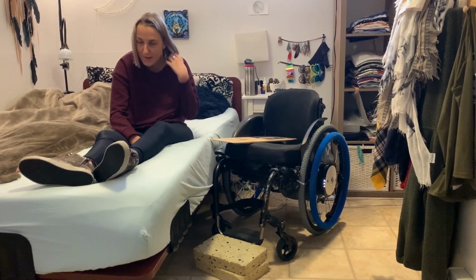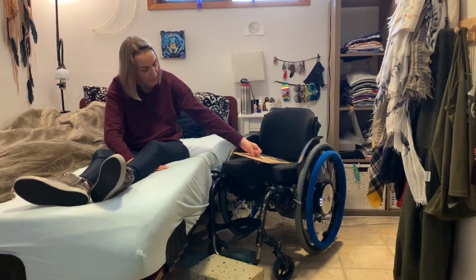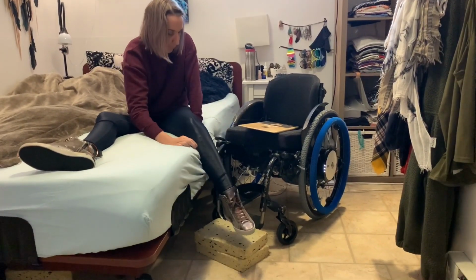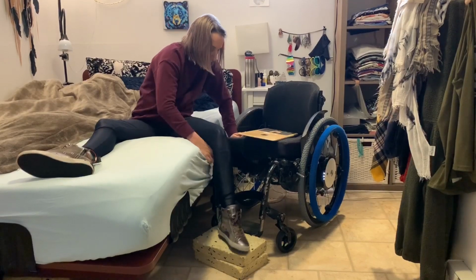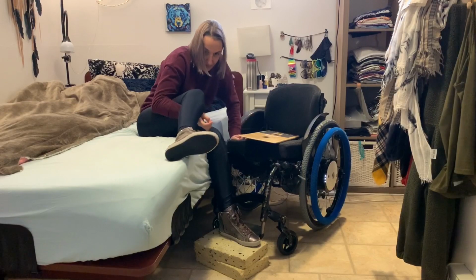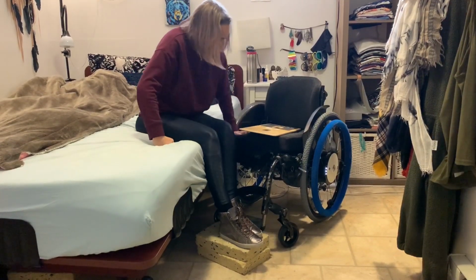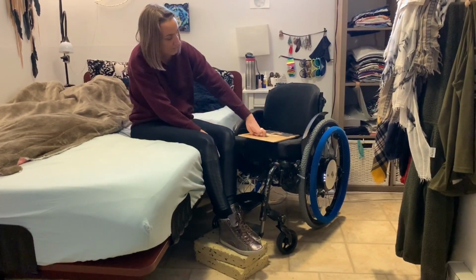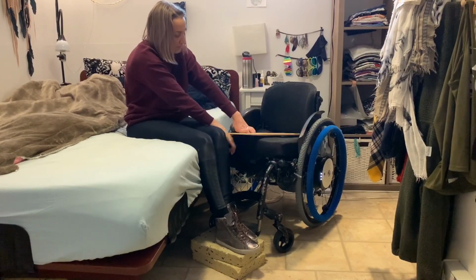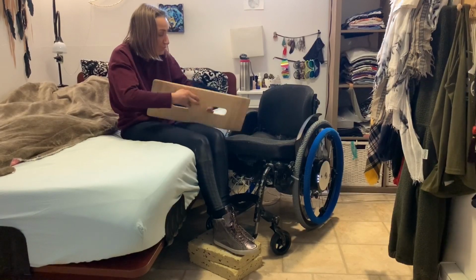Now transferring off the bed. So same thing, I need to put the board. I'm going to bring my legs down first, and then put the board underneath me. So again, the grippy part of the board goes towards the chair.